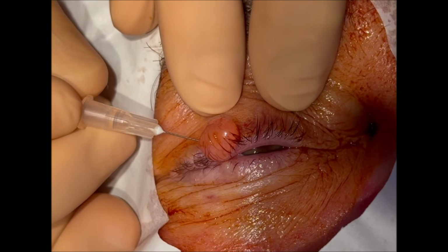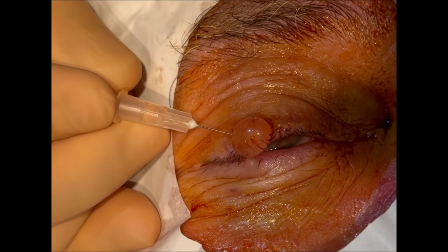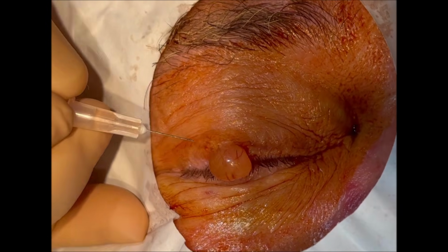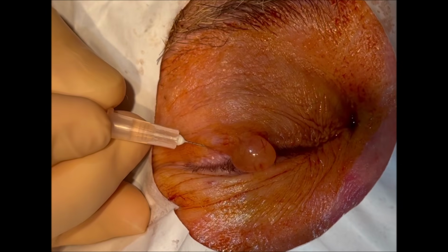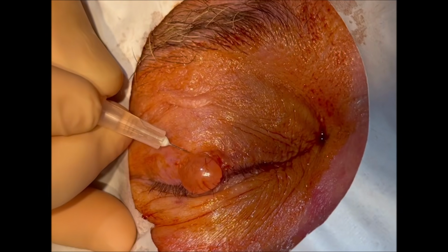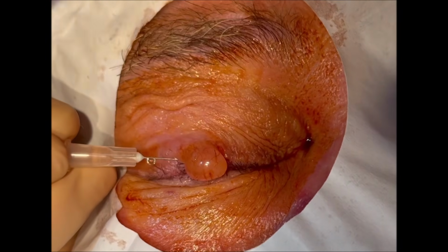And so this is lidocaine with epinephrine, just injecting around and underneath the cyst without puncturing the cyst. And that's really the key. Any type of cyst, if you don't remove it in its entirety, will have a tendency to come back. And so you want to make sure you remove the entire cyst, including the capsule.